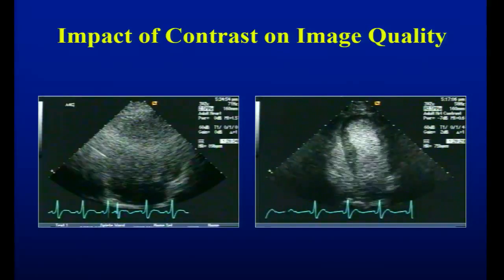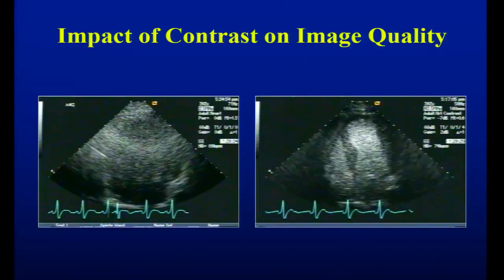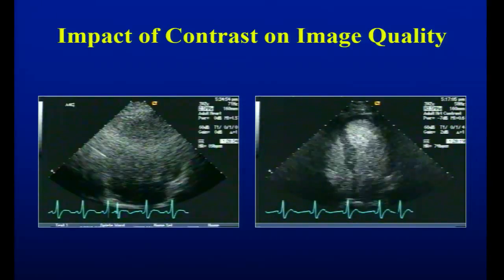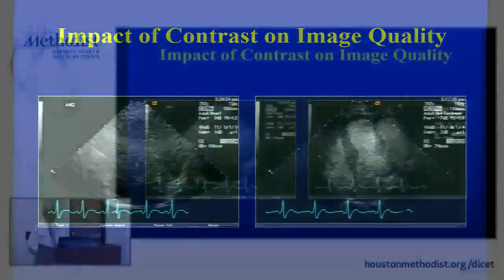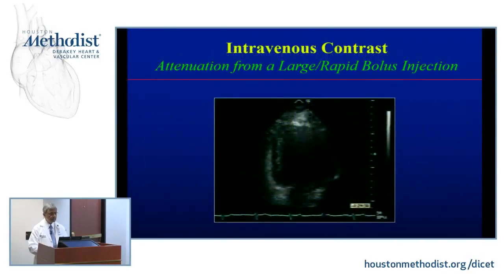The other indications that at times you use them for are really not approved for that particular indication, which is enhancement of Doppler signals on the left side. Stress echocardiography, we'll talk about that, is still not approved for that indication, although one of the companies is actually conducting a study. I don't know where it is at this stage of the game, but not yet published. So you will see some indication for that.